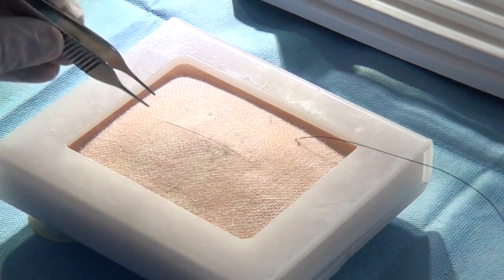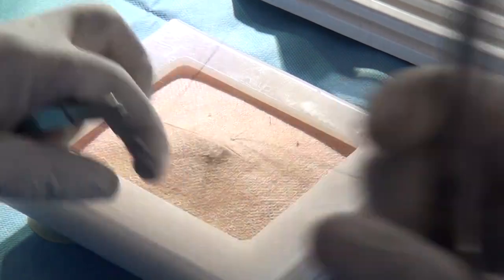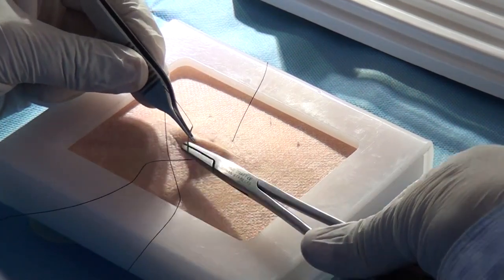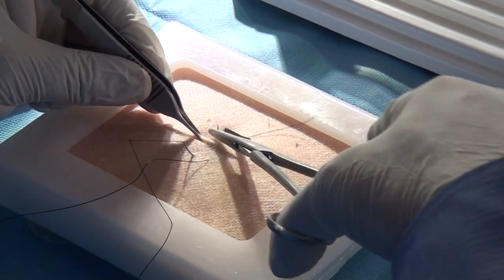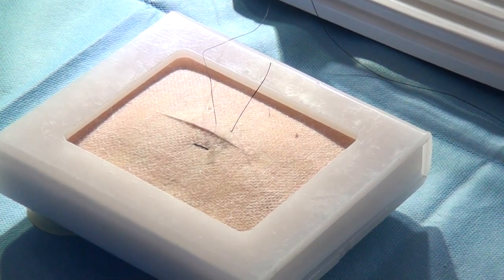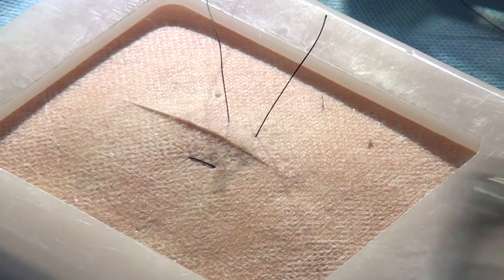I've taken a bite. And then we go parallel to it, that is a horizontal mattress. It is cosmetically inferior, but hemostatically better. Mattress would mean twice. So one, I take a deep bite and a superficial bite in the same line. The other is I take a deep bite and another deep bite parallel to it and then tie. That will put the tissues together.